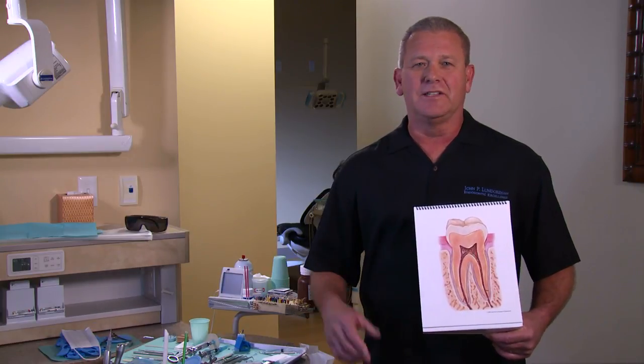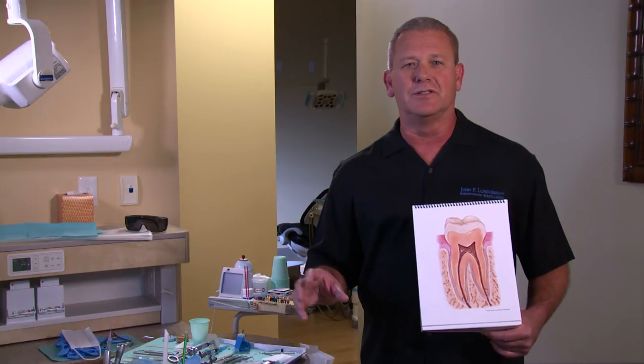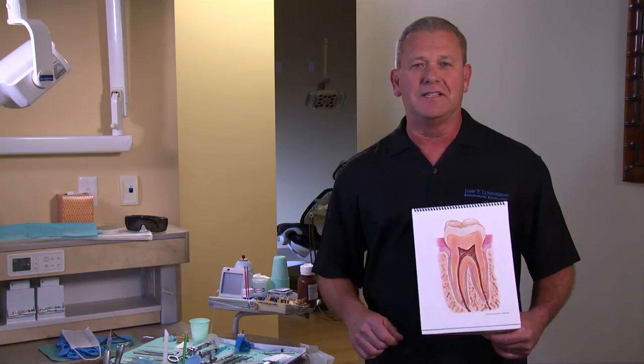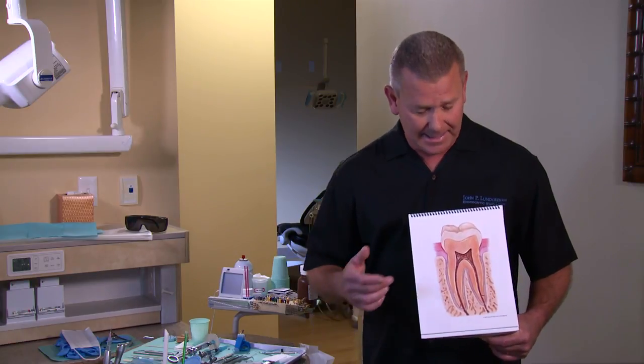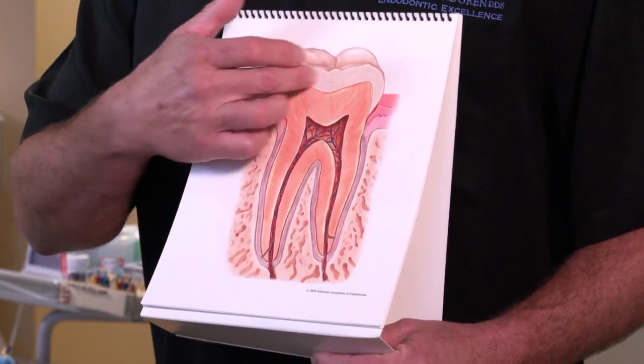When I see a patient in my office, we go through a very thorough diagnostic procedure, and once we've made the diagnosis, then I sit and talk to my patients about what a root canal is. This is a picture of a healthy tooth. There are three main parts to the tooth.